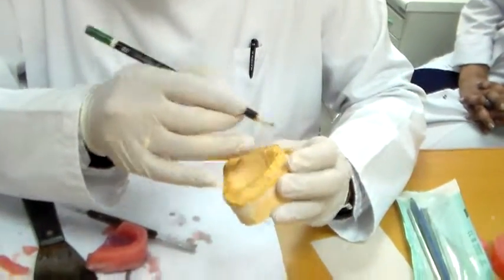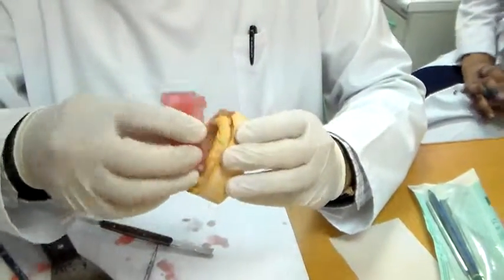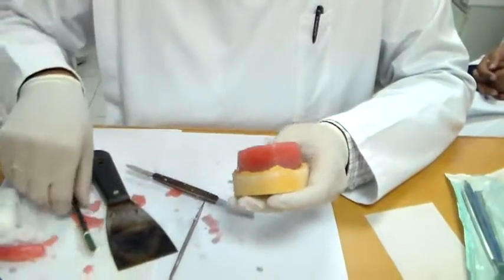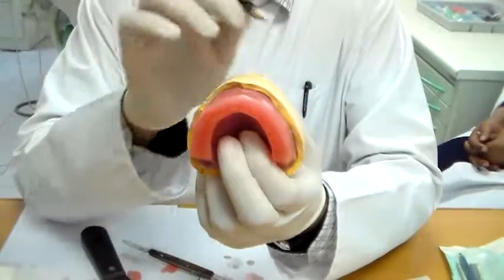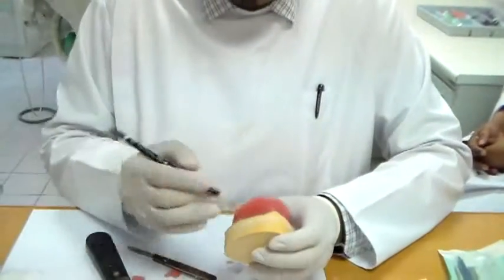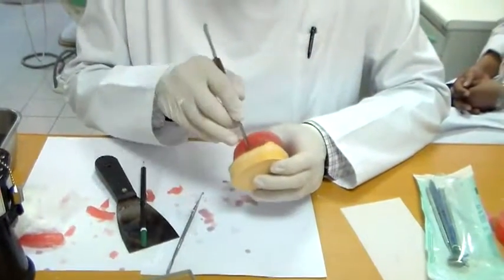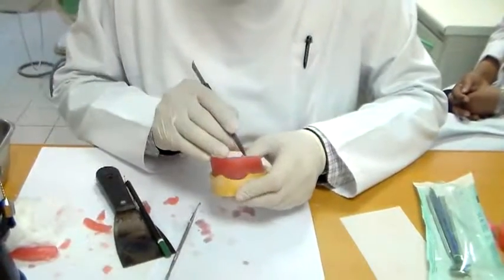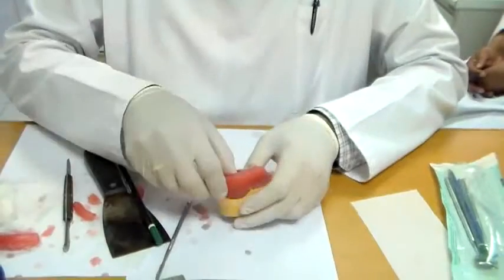Now this we will verify later on in the patient's mouth and correct it accordingly. So if I were to place this, it's going to come, as you can see, it's going to come here and here. Just make a mark, just a small mark, so I know where my canine eminence must be developed.